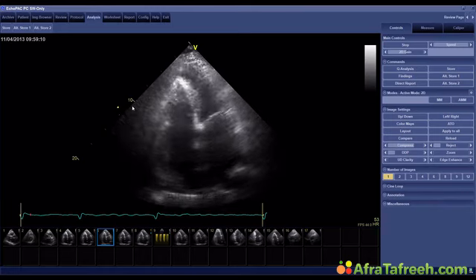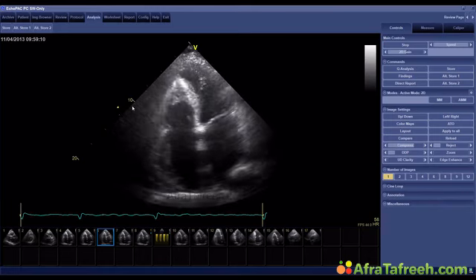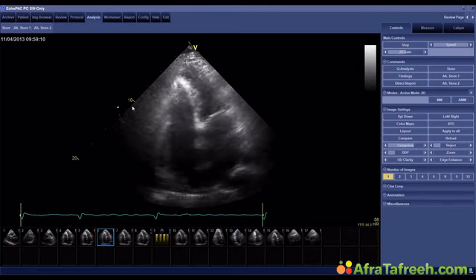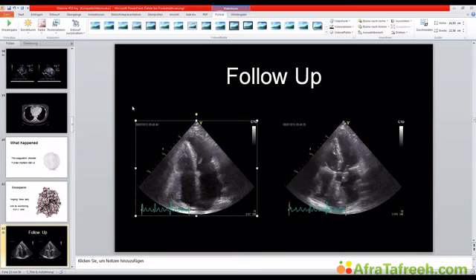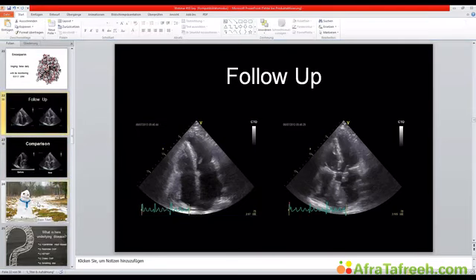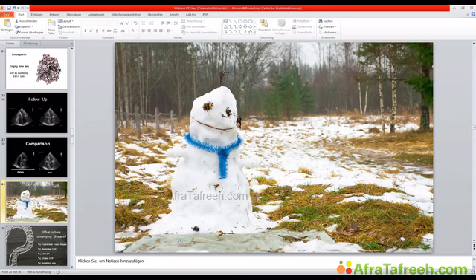We'll just have to wait because the thrombus has not dissolved completely yet, but we'll check on her. We have her scheduled for a TEE study in, I think, 3 or 4 days, and we'll see if anything has improved from the last exam. Okay, but showing you this case, this is why I called it this, I called this case melting, because obviously the thrombus is melting.